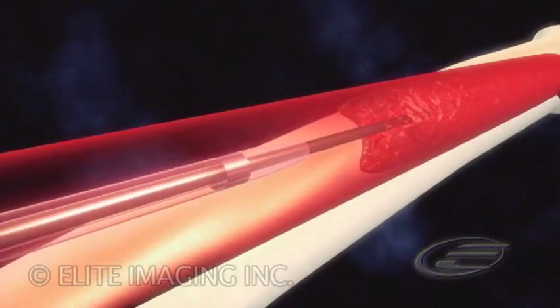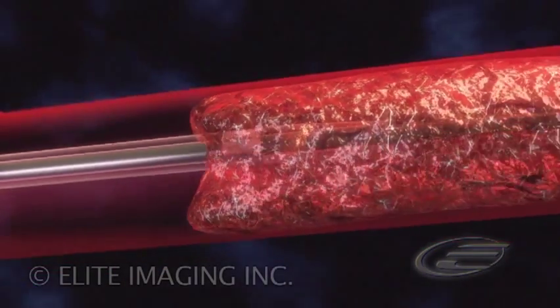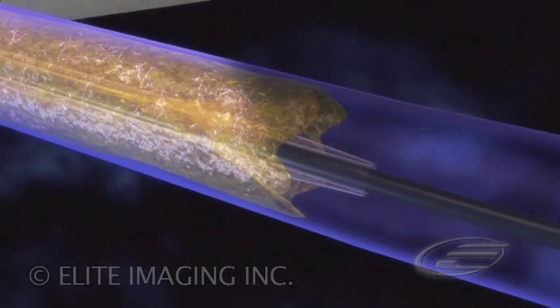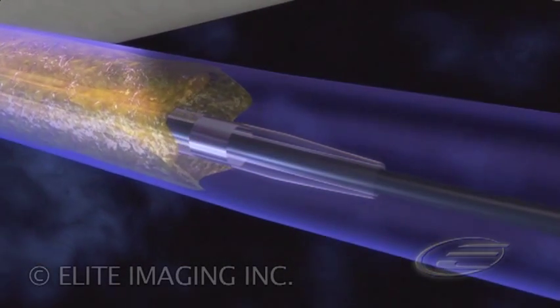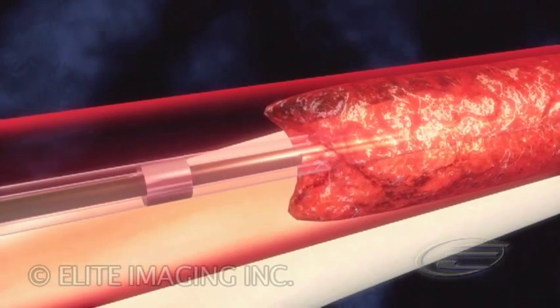The lysis drug delivery catheter is advanced over the guide wire until the tip of the catheter passes through the clot. The guide wire is removed.